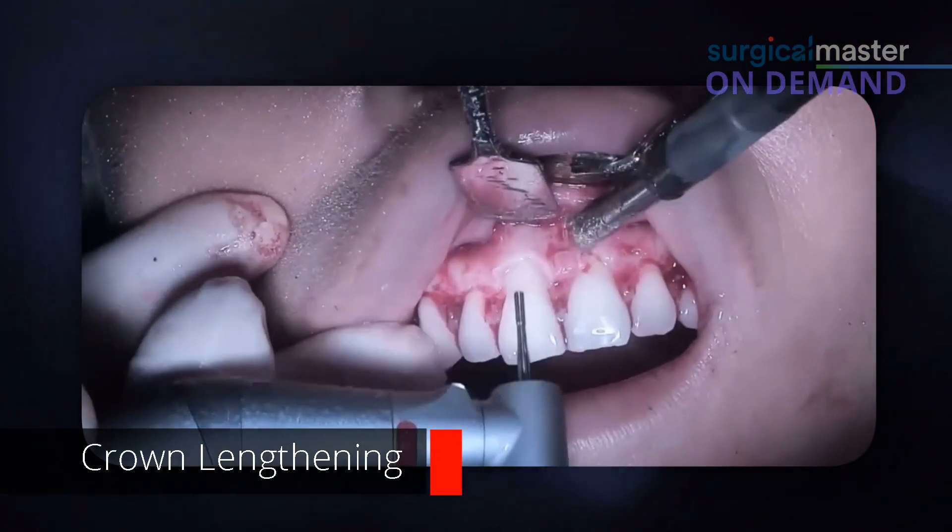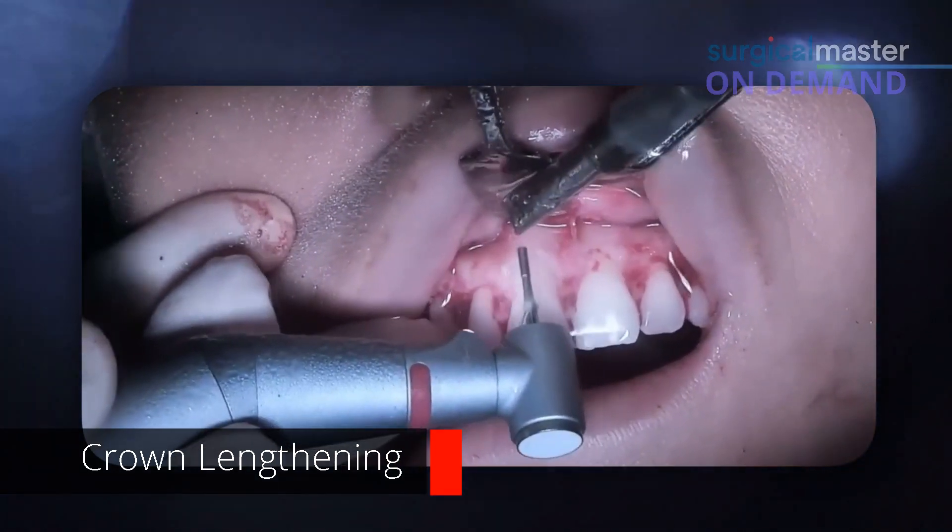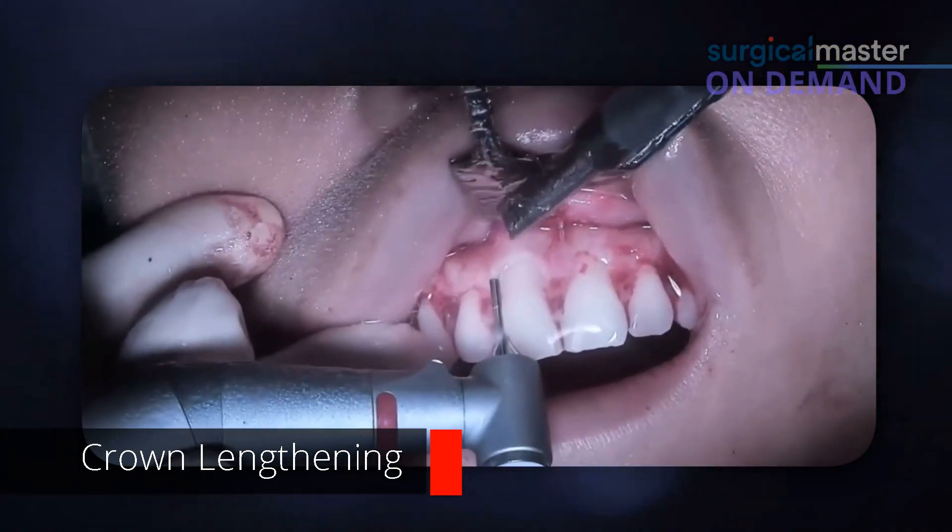Okay, so now what does this bur do? It creates a step. I wish I saw this video when I was starting — my teachers were showing me and holding it for me. The power of watching somebody do it is tremendous. I'm actually learning from my own mistakes here, how to do things a little bit differently.